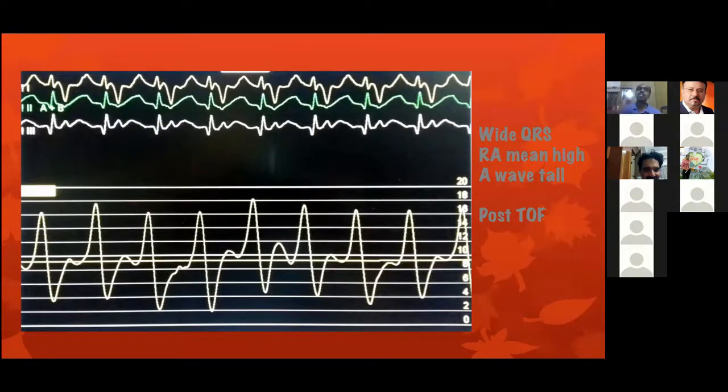So there is an elevation of the aortic systolic pressure, with corresponding elevation of the LV systolic pressure. If that left ventricle goes on to left ventricular dysfunction, there will be decapitation of the LV systolic pressure. Again, the LV pressure will come down to 120 to 130. The left ventricle has started to fail.